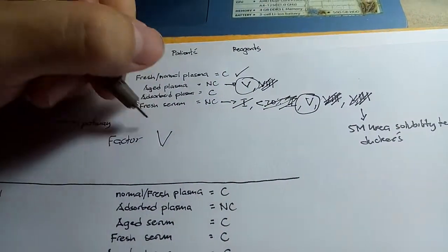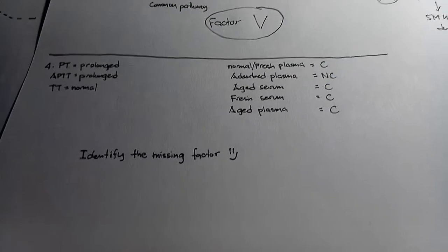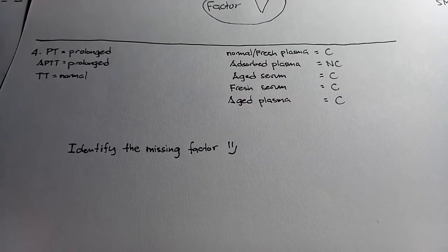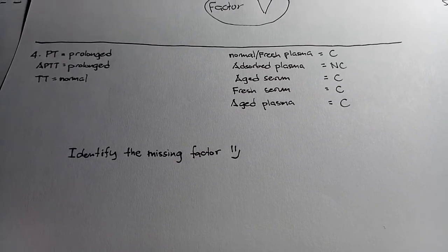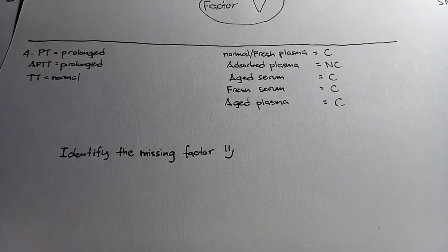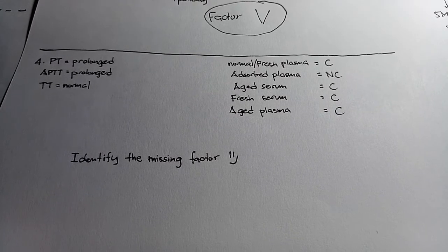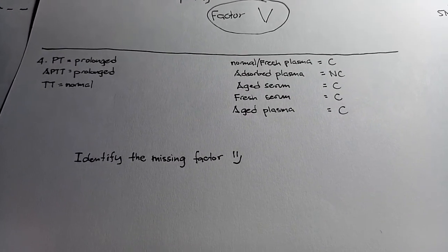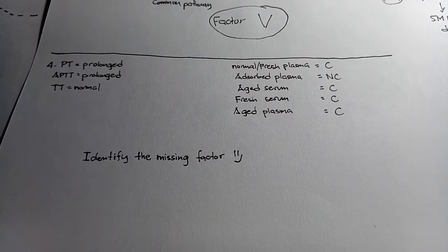Okay, so for number 4, you do it yourself. So, try nyo namang i-identify. Kung gusto nyo i-try, ayan. So, don't forget, identify muna kung ano yung mga na-prolong, identify kung anong pathway sa coagulation cascade, then tignan kung corrected or not corrected ba.